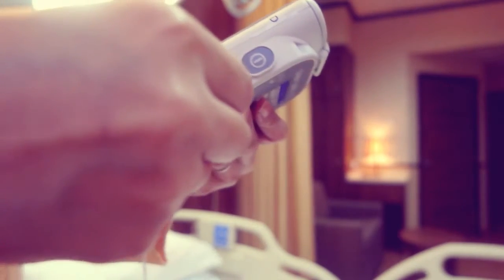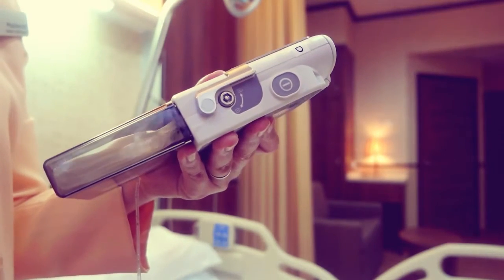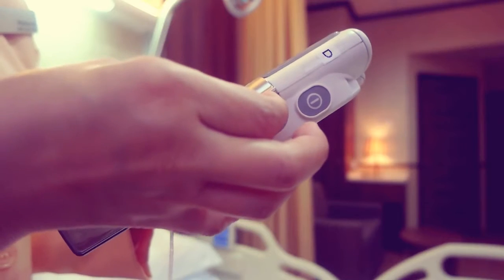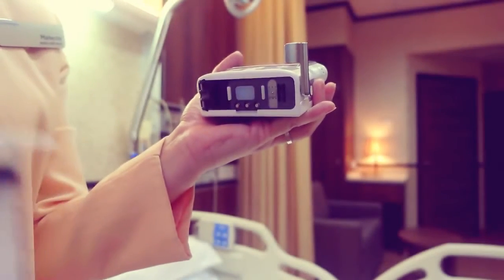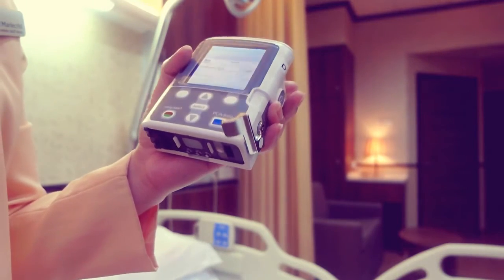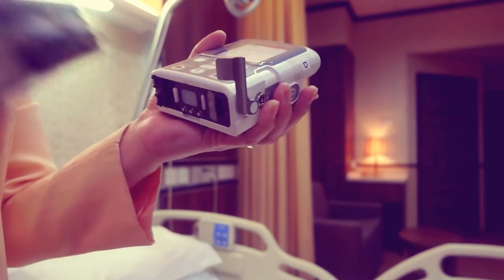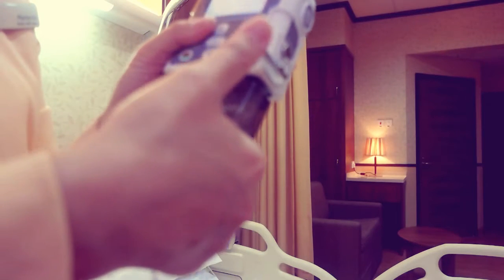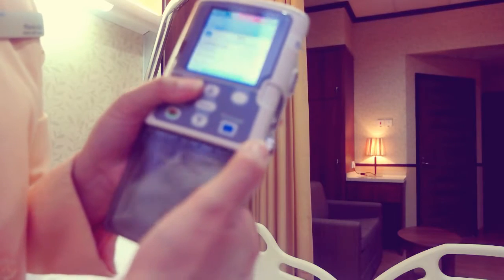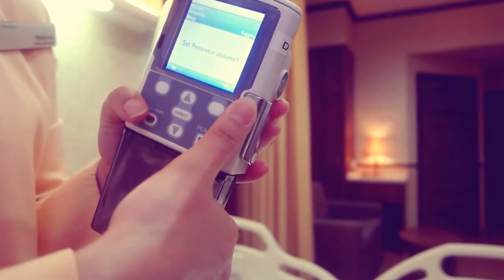To remove the cassette, insert the pump key and turn the cassette lock counterclockwise into the unlocked position. Push down onto the cassette latch until the cassette detaches. To attach the cassette to the pump, make sure the cassette latch is unlocked and open. Insert the cassette hooks into the hinge pins on the bottom of the pump. Holding the pump in your hands, push down on the cassette latch and push up on the cassette until it firmly clicks into place. Lift the cassette latch into the closed position. Insert the pump key and turn clockwise into the locked position.